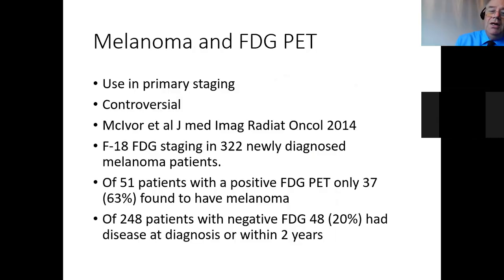What about melanoma? We can use this in primary staging. The role of that is still a bit controversial, but more and more, in any patient who has a high risk primary, we're doing preoperative staging because we don't want any surprises. And any patient with a positive sentinel node, we're pretty well doing FDG PET now, even though some of the literature is not particularly brilliant.